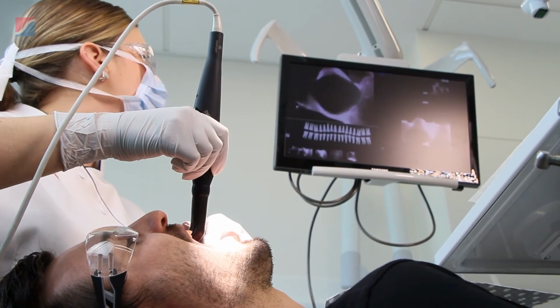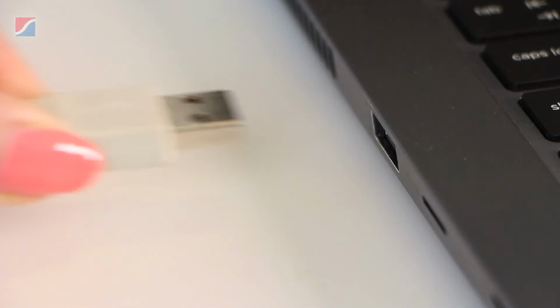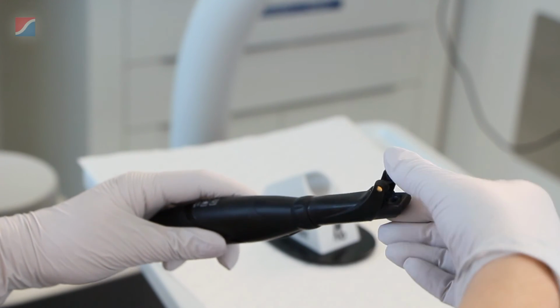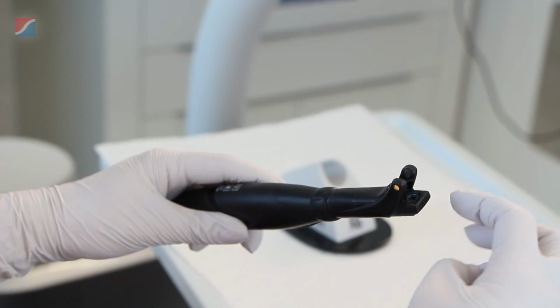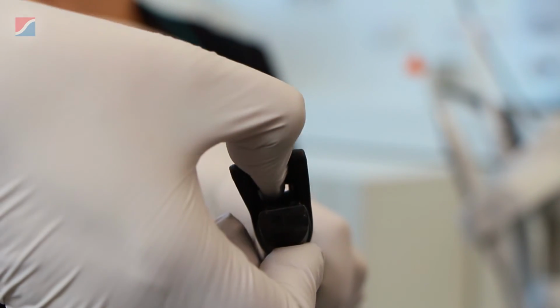The patient doesn't have to clean and dry their teeth, it's literally plug and play. Essentially, the DIAGNOcam tool plugs into your USB on the PC or laptop. The handpiece of the DIAGNOcam has 2 infrared lights, which emit from the handpiece. Then there's a black tip which has 2 arms, and those arms will straddle the patient's tooth. Those arms actually carry the transillumination.